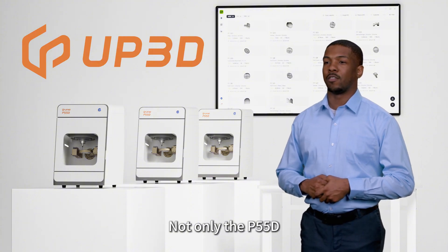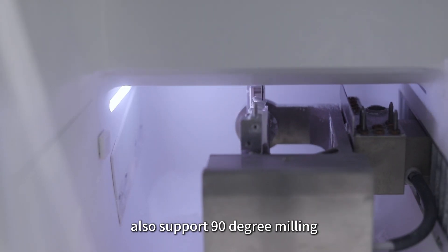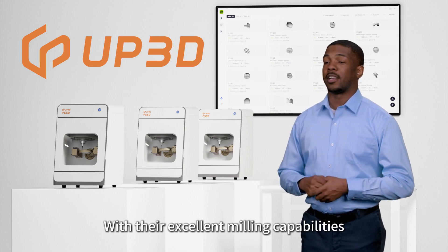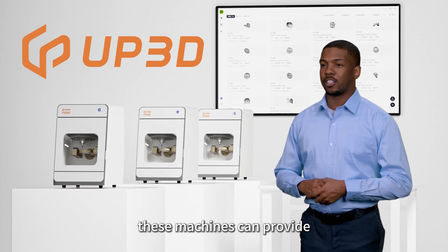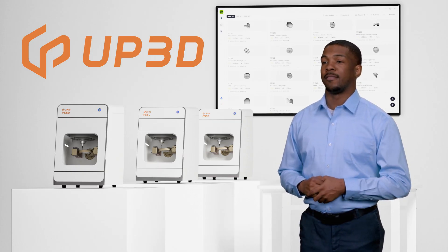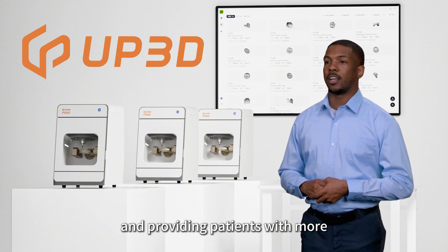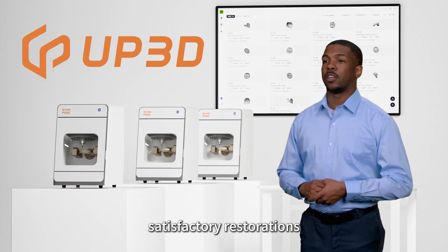Not only the P55D, but also UP3D's other machines, such as the P53 and P53DC, also support 90-degree milling. With their excellent milling capabilities, these machines can provide efficient and precise solutions for complex restorations, meeting the diverse needs of both the laboratory and the clinic, and providing patients with more satisfactory restorations.